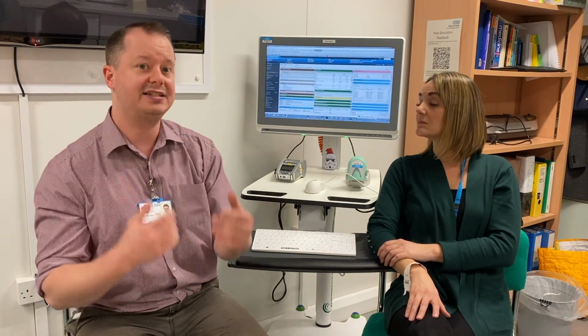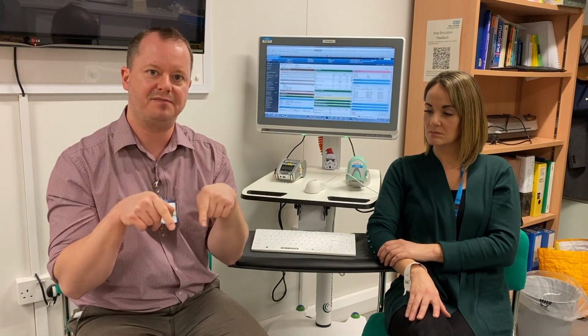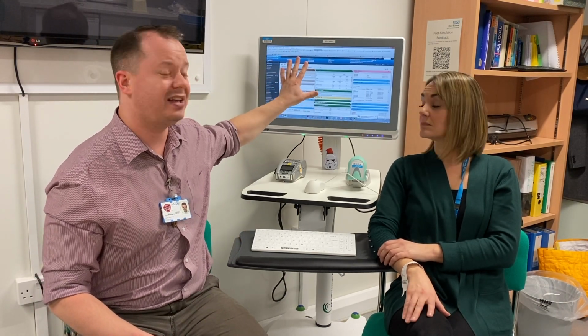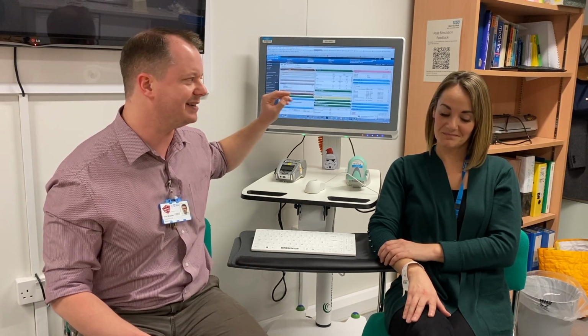So you'll need something with you which will have the patient's details on, which is what you're going to use to label your sample bottles. If it's a blood transfusion sample, it'll be a bit of paper with the patient information on, and if it's a standard blood sample, it'll be the patient's e-care record. Now this is a simulated patient, so don't worry, we haven't got any secret record behind us.